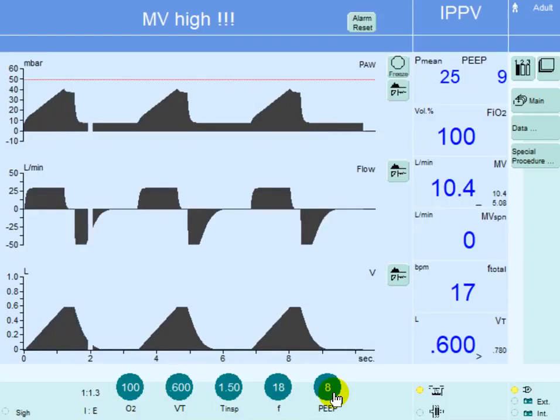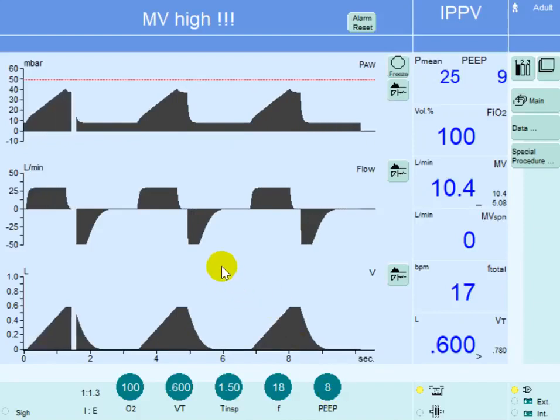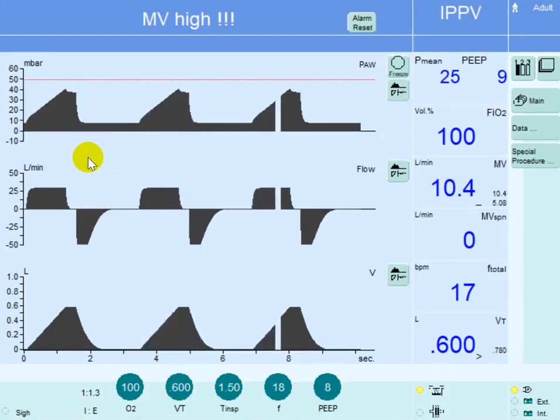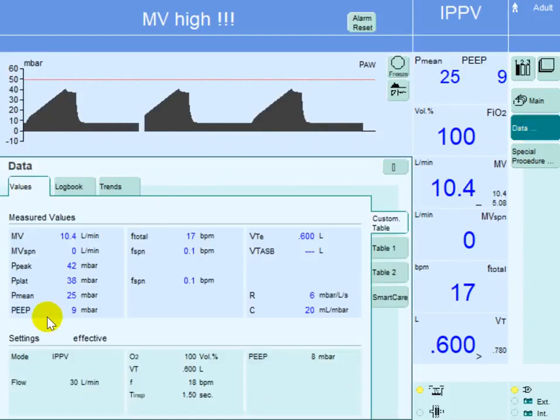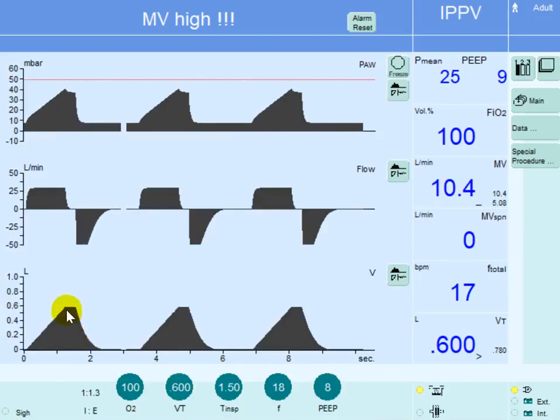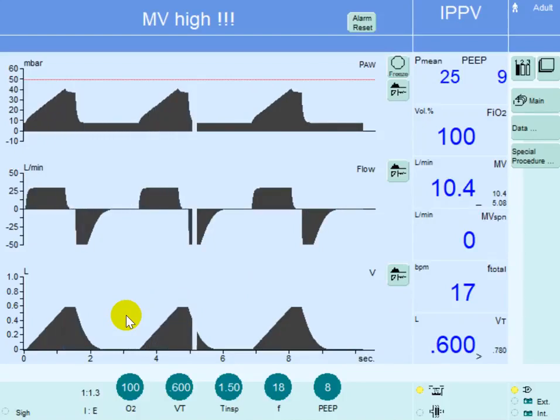When analyzing the ventilator graphics, we identify the problems in ventilatory management of this ARDS patient. The first problem is that the plateau pressure is elevated at 38, which is too high. The second problem is the tidal volume of 600 ml — given the patient's ideal body weight of 70 kg, he should be ventilated with only 4 to 6 ml per kg of ideal body weight.